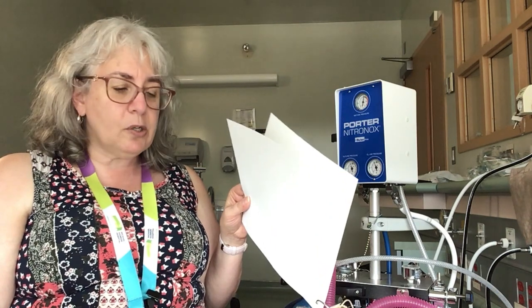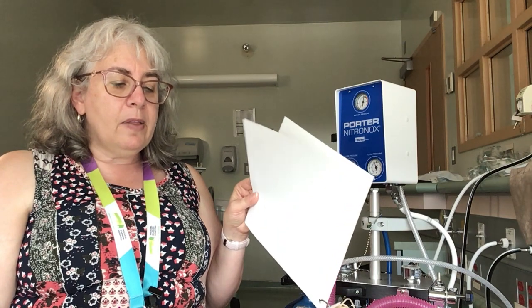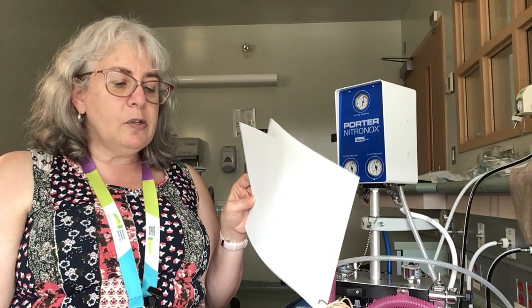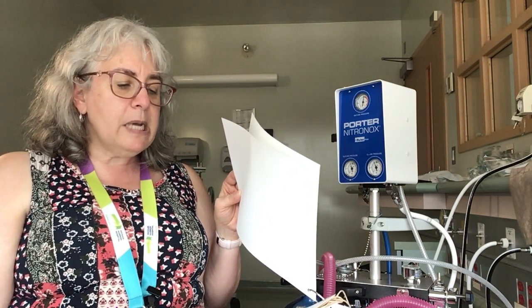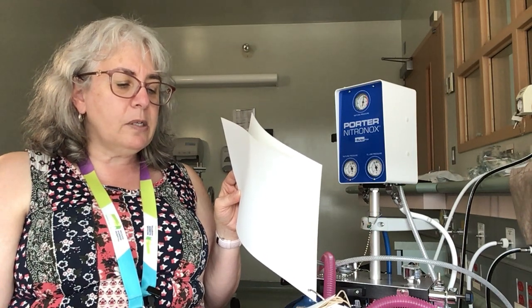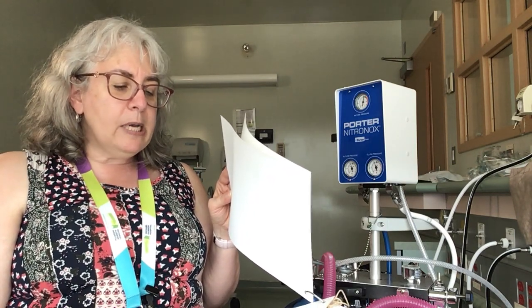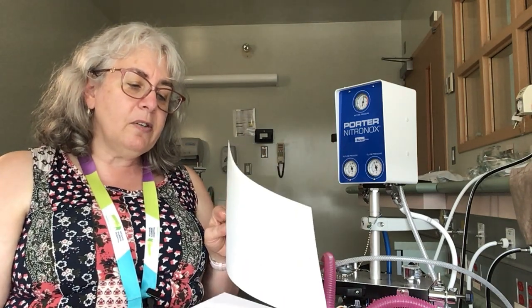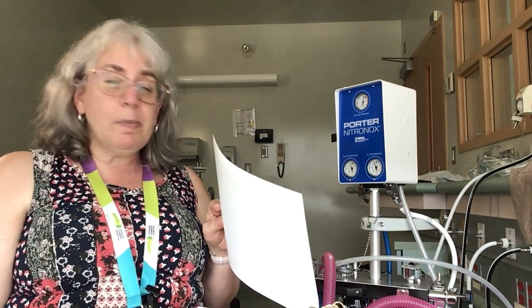So we're going to stop the nitrous oxide at that time and notify the healthcare provider. If it's a midwife, they will notify the OB, and if it's a nurse, they'll notify the OB and or the family practitioner. Providing oxygen by mask at 8 liters per minute, taking vitals, probably at this time putting external fetal monitor on if the patient hasn't already been on the monitor, and being prepared to increase the oxygen to 100% at 10 to 15 liters per minute if the patient becomes unresponsive, checking for pulse and breathing.